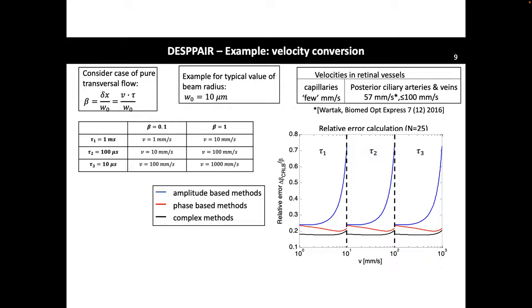The second question is, what is the relative error on measuring this flow? How many measurements do you need, and what is then the error? So the assumption here is that we do 25 measurements. So we measure 25 phasor pairs. In practice, that means 26 measurements, because then you can compare 1 to 2 and 2 to 3 and so on. So, and then I have the distribution.